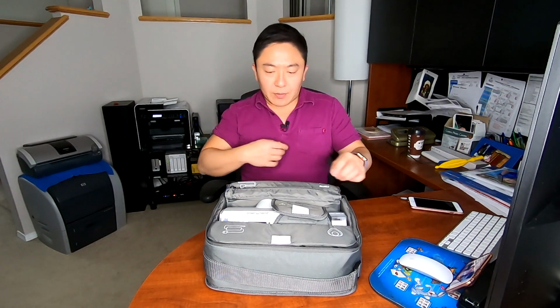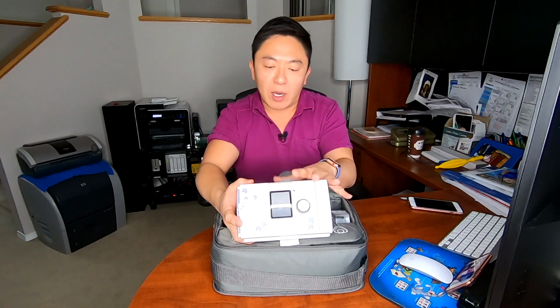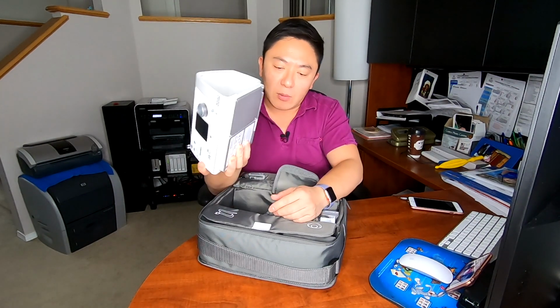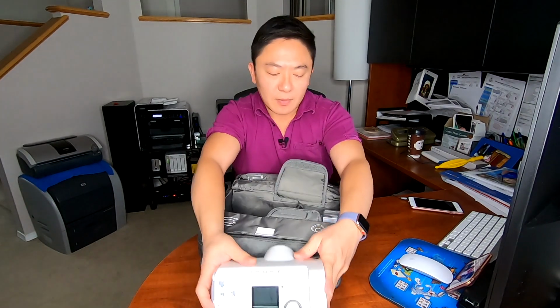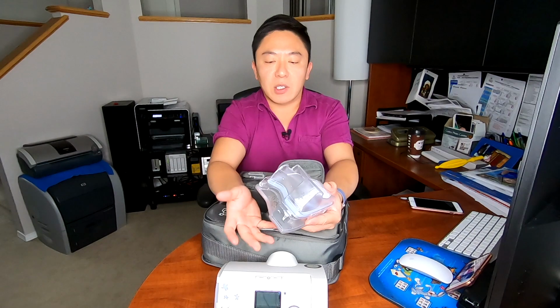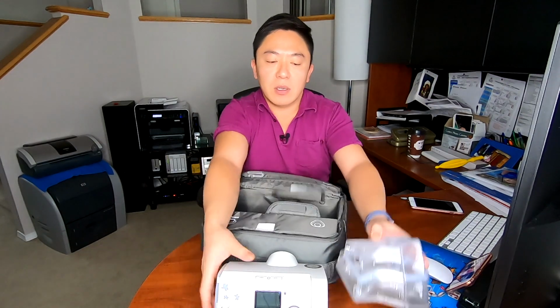On the inside of the unit, we've got our CPAP machine, which is the primary blower device, and it's got all the blower and the brains and the heating plate for the humidifier all in one unit. It's about 3 pounds and the size of 2 of my hands. We've got the water reservoir here that is used for humidification. It couples with the heating plate down here. You fill it with clean distilled water. It slides on like so.